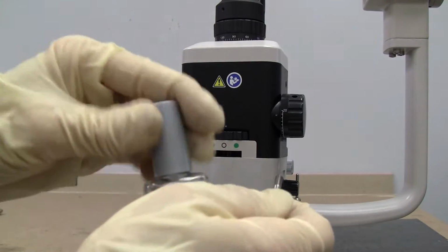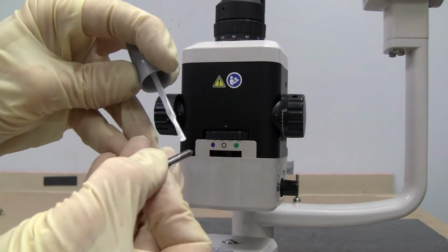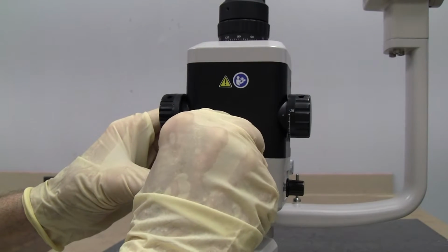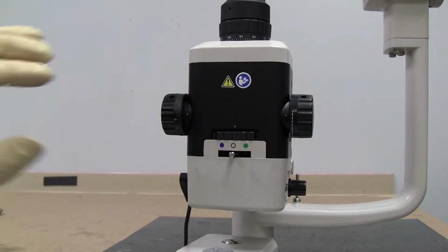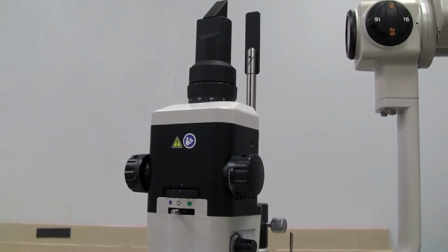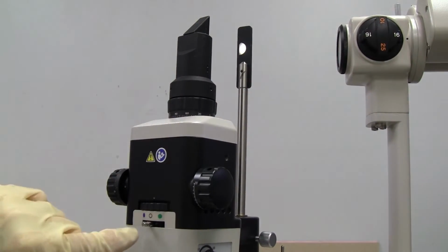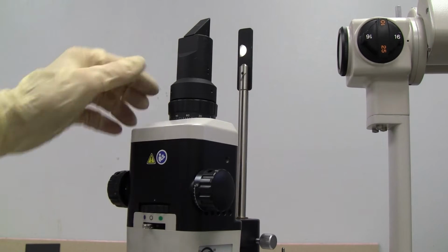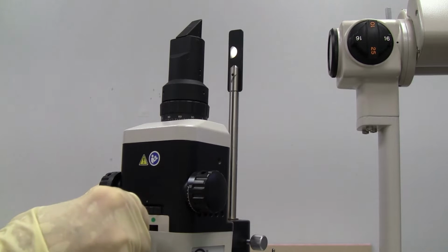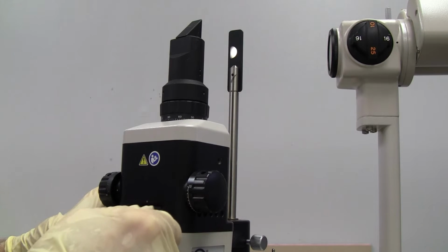Okay, I'm going to put a little bit of, oops, just a drop. Okay, now I'm going to want to line it up, so I'll turn my power on, and I can see that even though I've got this in the center, it's way off. So I'm just going to loosen it, turn it a little bit, and then hand tighten it and turn it whichever way it needs to go to get it back into the center.